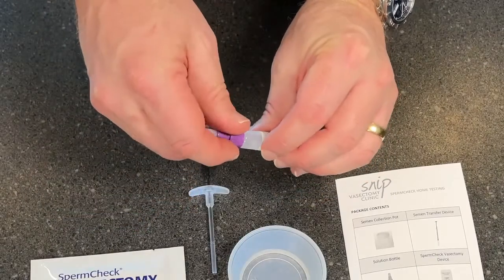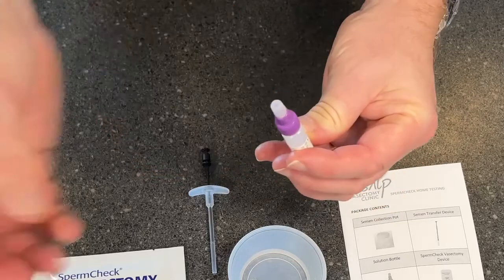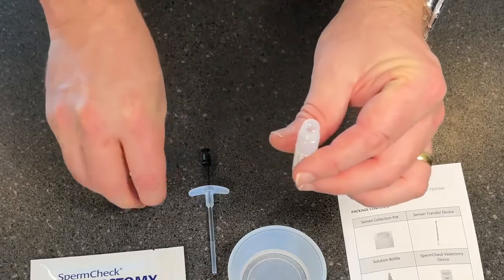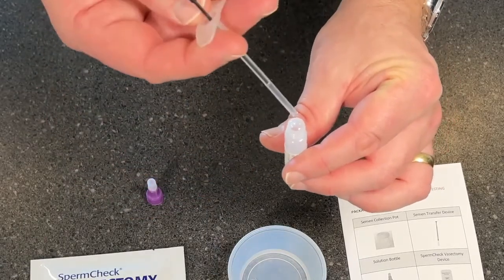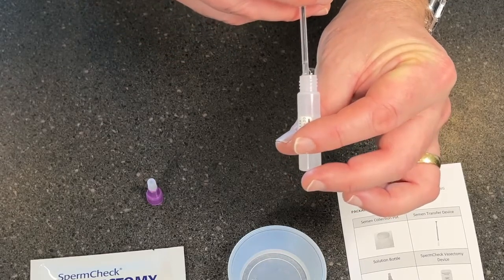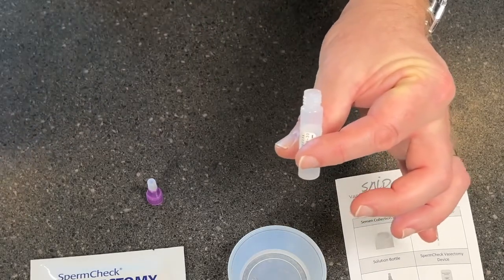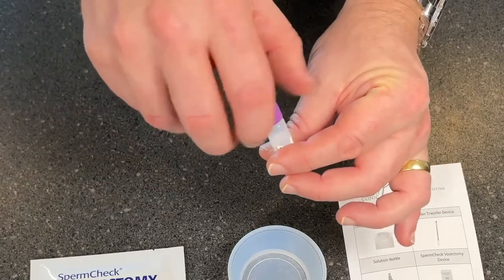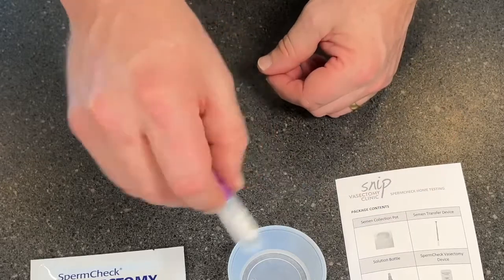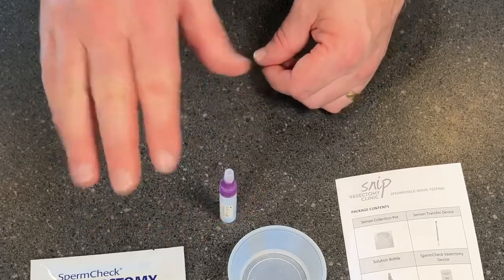We're then going to take the lid off the reagent bottle. Make sure you don't have it turned upside down when you do that, because there is some fluid inside. Take the lid off, then place the end of the transfer device into the bottle and push down the plunger to drop the semen inside. You can then put that off to one side. Place the lid back on, and you want to mix it — but don't vigorously shake it. Just give it a little stir by spinning the tube around. Then that's going to be ready.